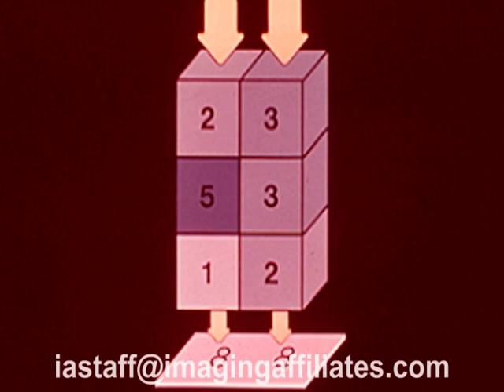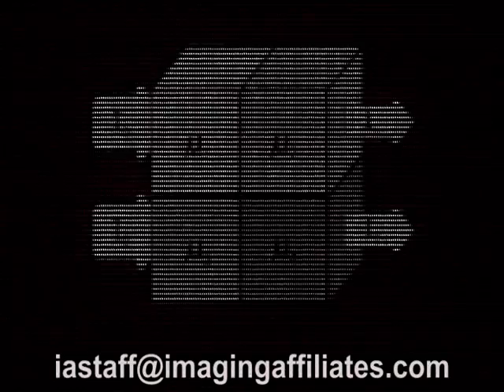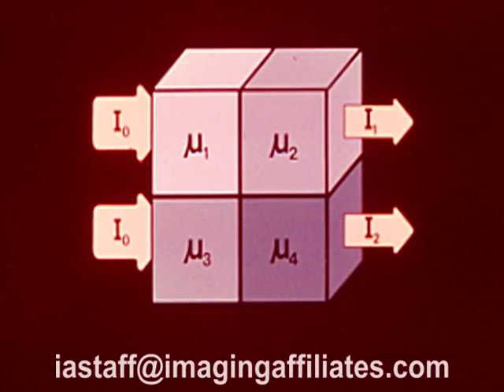It's quite conceivable that although the tissue pathways differ markedly, the total attenuation of the beam could be the same, so that the film exposure will also be the same. It's not possible for the physician interpreting the film to mentally reconstruct the various types of tissue along the beam path. Before more specific information can be gained about different tissue attenuation coefficients, it's necessary to gather more data.